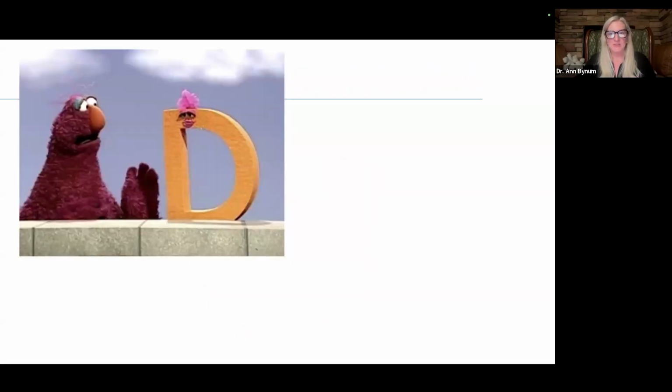And then somebody mentioned in the chat about the direction of the needle. On these proprietary Effitech needles, there's a letter D for Dental High Tech, the company that developed them. And that D needs to always be facing out. It needs to be facing facially, buccally, whatever you want to call it, facing towards you, because that's telling you that you have the correct orientation of the scalpel blade of that needle as it enters into the tissue for stage 1. It's only critical for stage 1. When you're doing the intraosseous portion, it doesn't matter the direction of that needle.